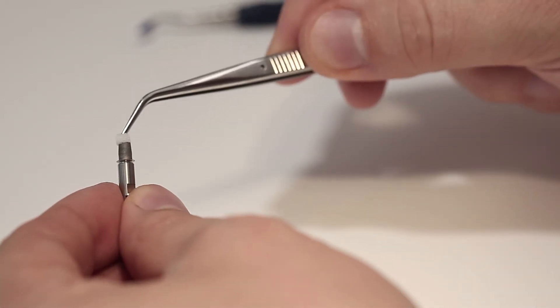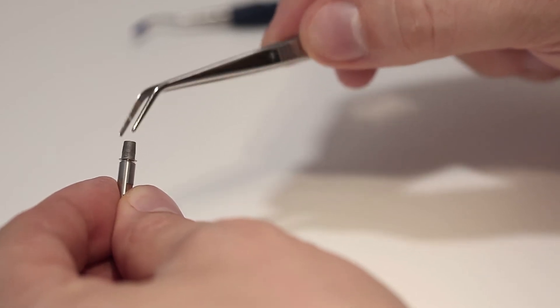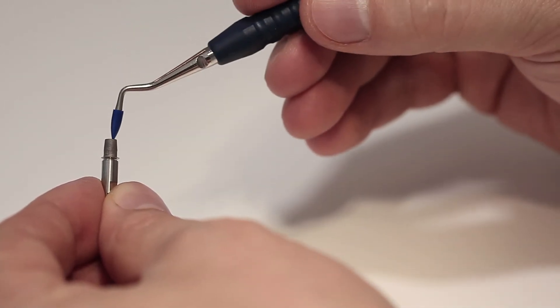Seal the screw channel with a foam pellet or wax. Be careful not to contaminate the bonding surface.